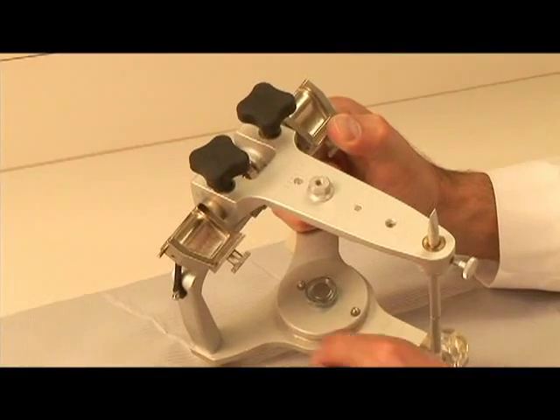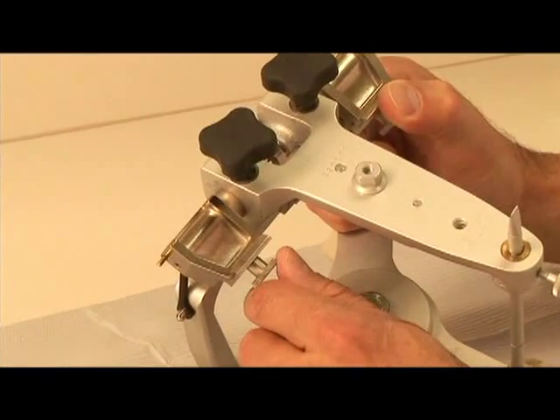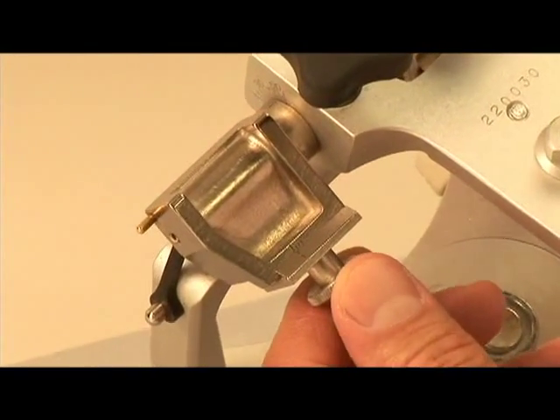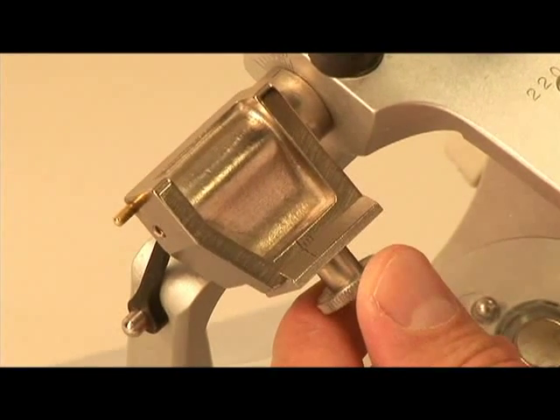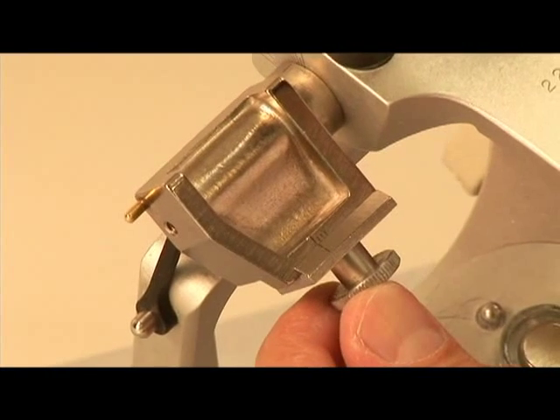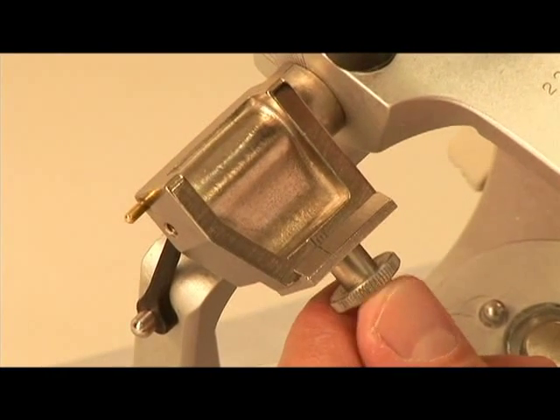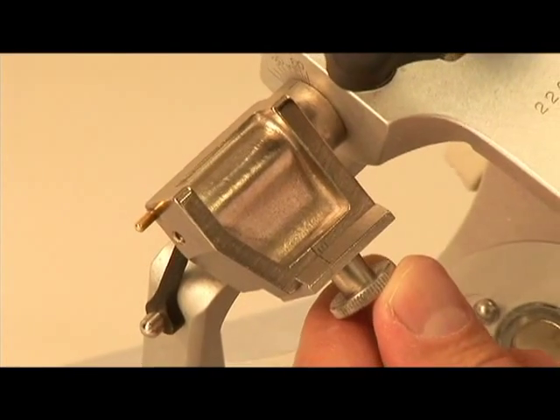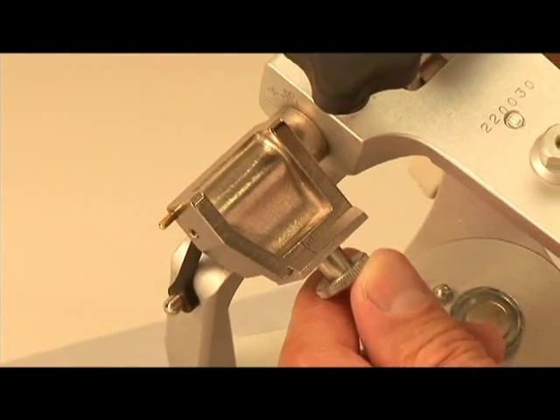The second part of the articulator that needs to be checked is to make sure that the side shift guides are set to the 0 position. Aligning the long line on the removable piece of the side shift with the tallest line on the stationary mount allows us to position that side shift to the 0 degree point.